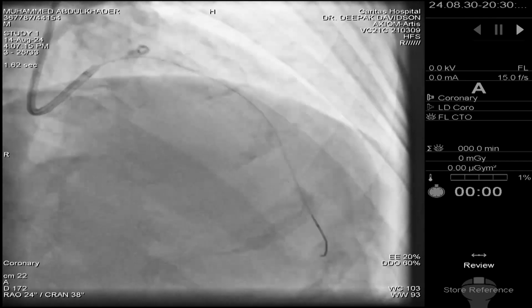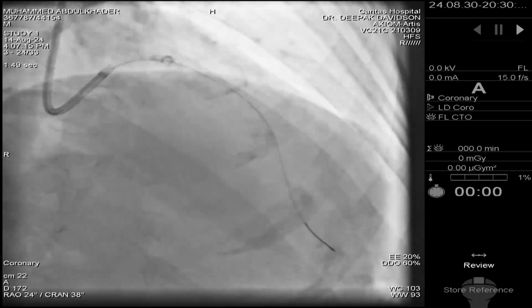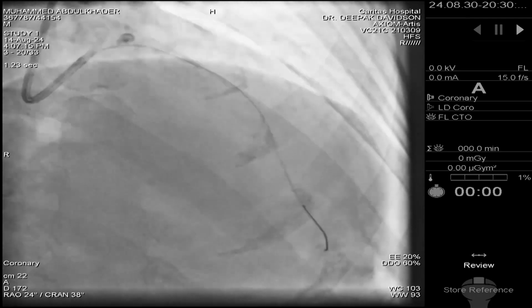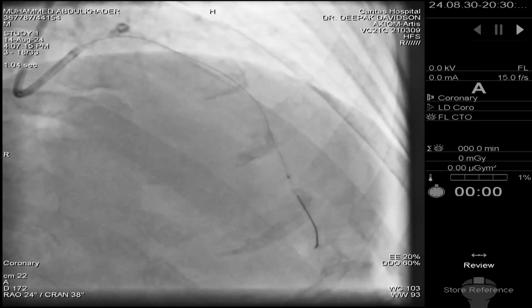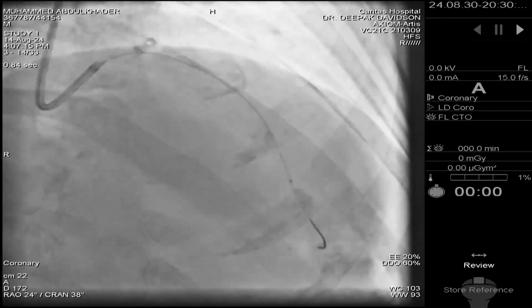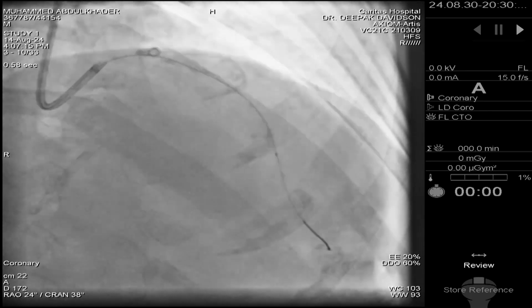By and large, when you do orbital atherectomy, you don't need a temporary pacemaker lead inside the right ventricle. That's the routine practice. But yesterday when we had a case done for an RCA, we saw AV block during the procedure. We didn't have the temporary pacemaker in, but compared to rota, with orbital atherectomy, even when they develop AV block, it immediately resolves. We didn't even have to give atropine. There was a significant amount of brady, but it resolved by itself.